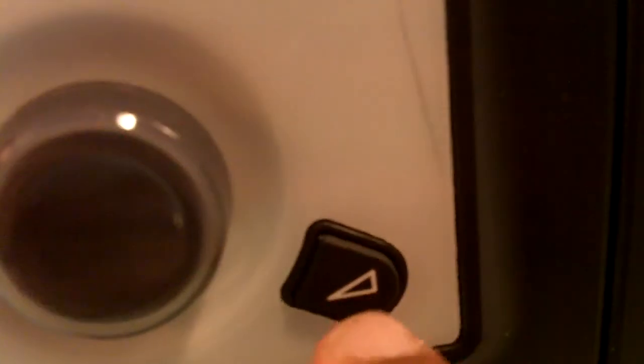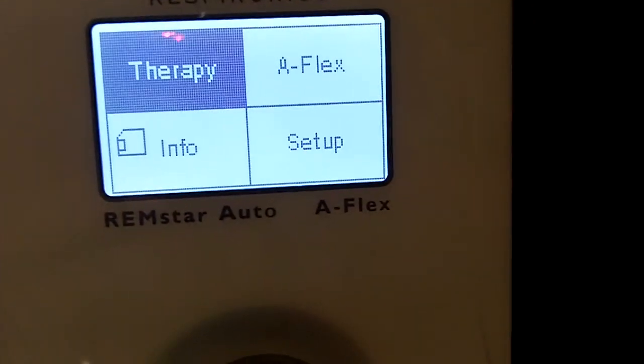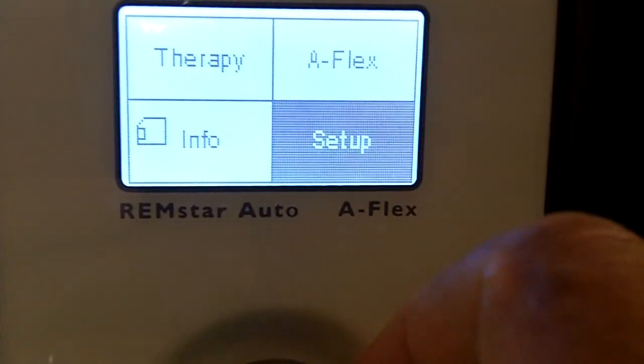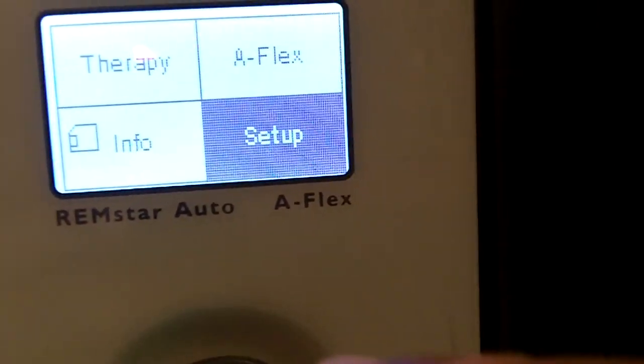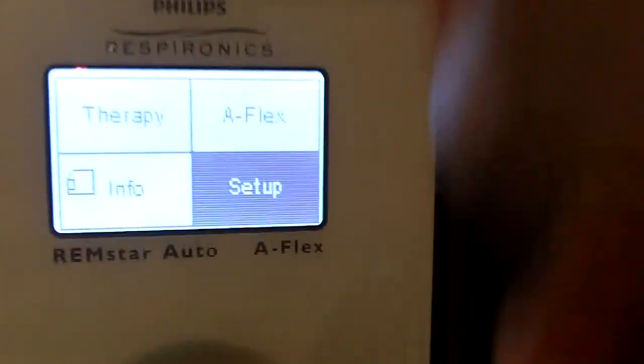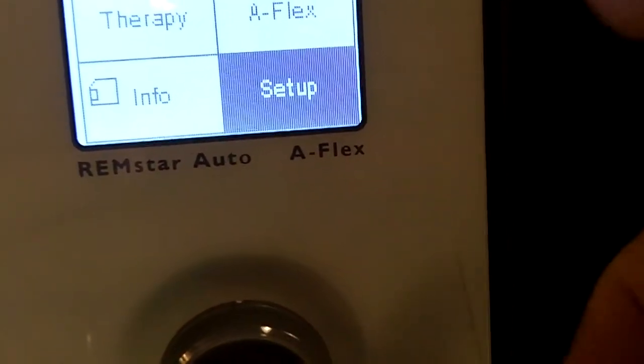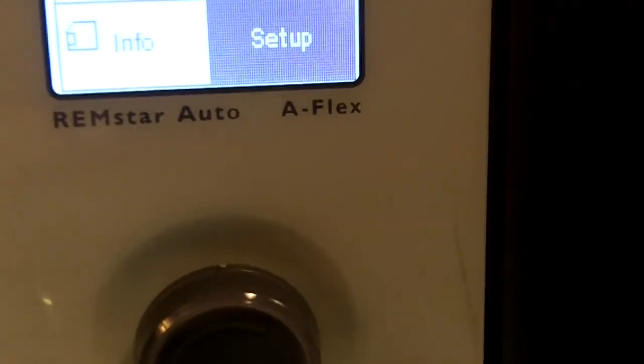But if you press this button that has the ramp symbol on it, it is going to drop the pressure. For example, if the ramp pressure is set to 5, it drops to 5. The doctor will tell us how long to set it, for example 20 minutes, and over the next 20 minutes it starts climbing up, bump, bump, bump, up to 10. This makes it easier for you to get used to, so you don't feel like it's a tornado blowing down your face.